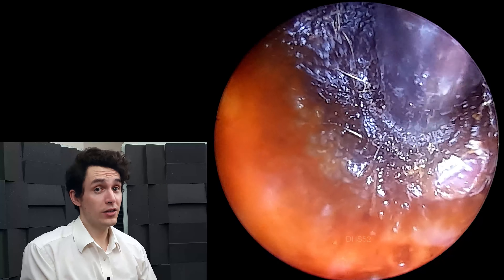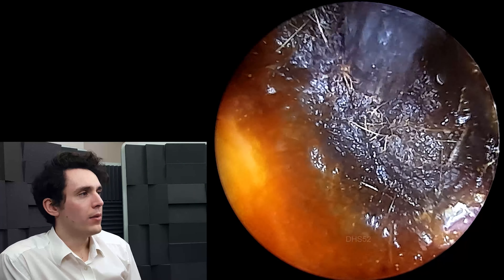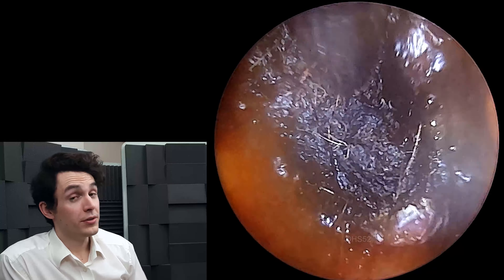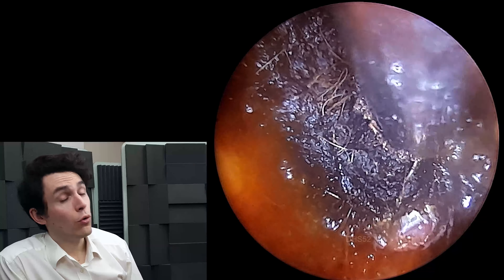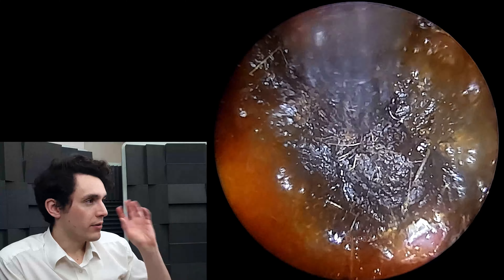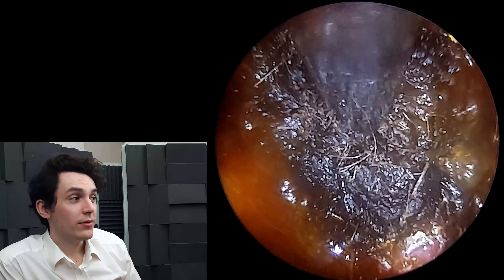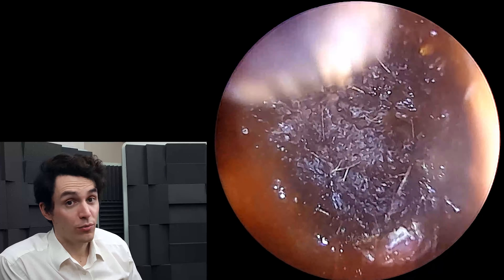It's something that you learn over time — the more you use an endoscope, the more you get a feel for it. But no amount of experience or training can really substitute for direct vision — looking down the eyepieces of a microscope or loops. So these cases would probably be a little bit easier with an ENT microscope, like an operating microscope.